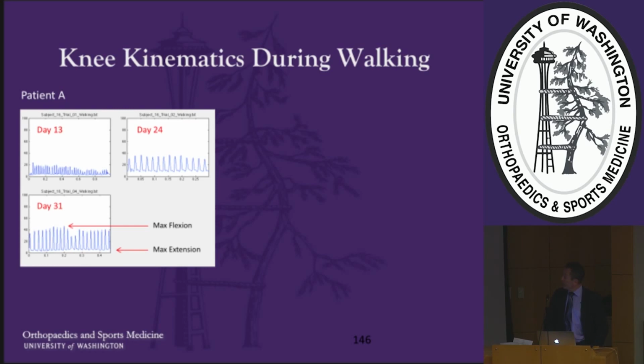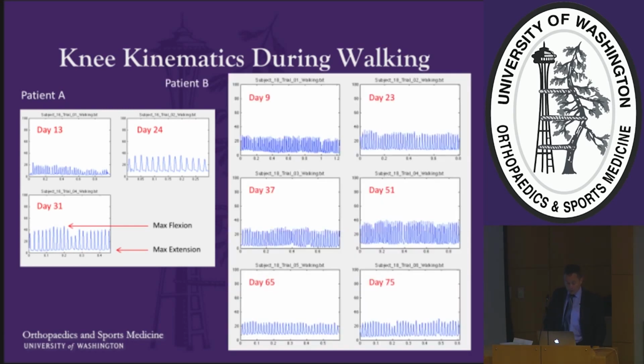Well, you can also decipher whether patients are confident in their walking. What you see here is that patient A has resumed a normal walking pattern, whereas the second patient started out okay, but really never got very far. And again, the reason for this is that the patient didn't exercise. We would not have known about this until 90 days out. With remote monitoring, we can tell right away, and we can either get on the phone or get in contact with the patient somehow and tell them, get back to physical therapy.